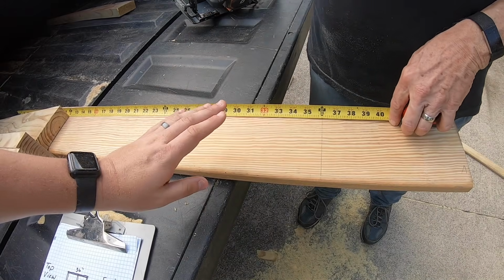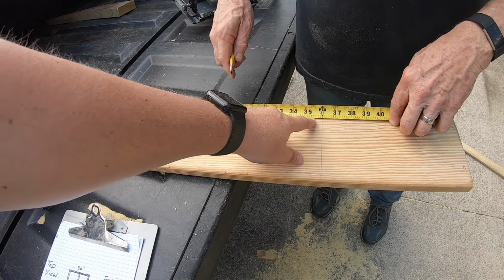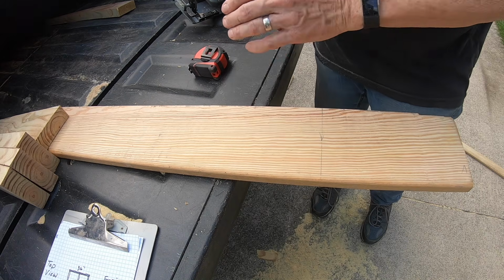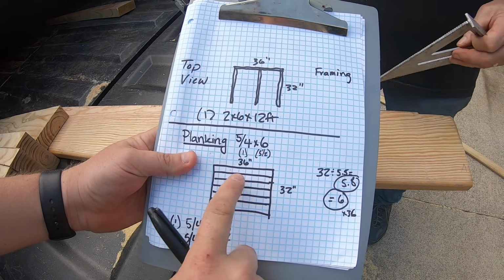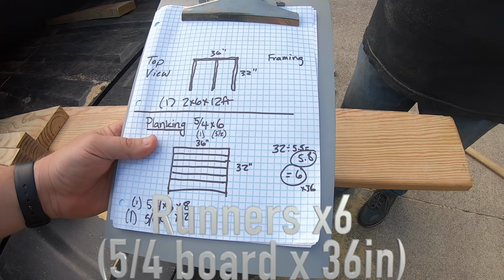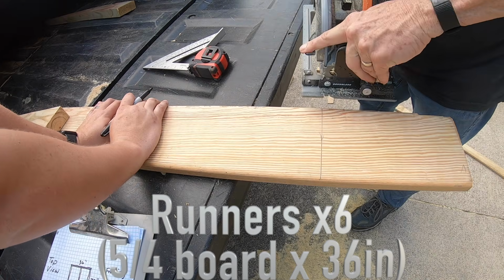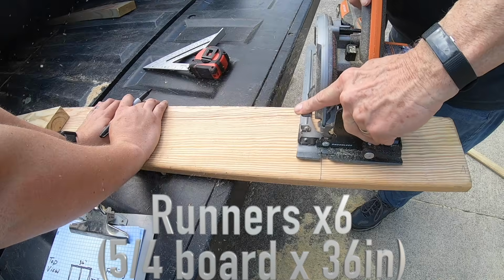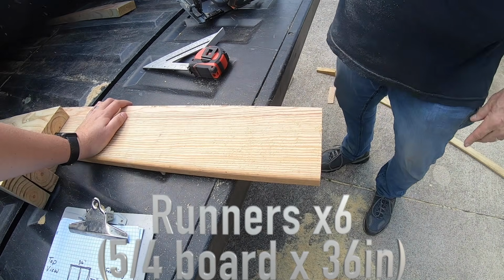So the next step is go ahead and get all of your planks. You're going to need 6 of them at 36 inches. So you can go ahead and draw your line and you'll have the ability to cut. You'll need 6 of those. Because remember, this is what we're doing right here. It's that 5/4 board, which is about 1 inch thick by 6 inches, well, really 5.5. And then go ahead and pre-cut all of them. You'll do 6 of these total. And then just repeat that 5 more times.